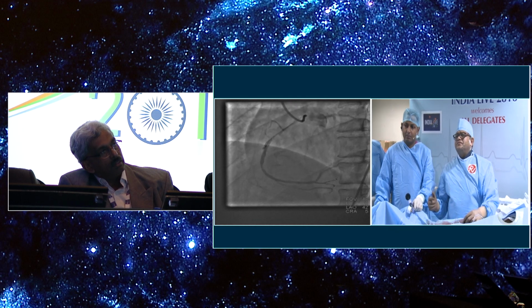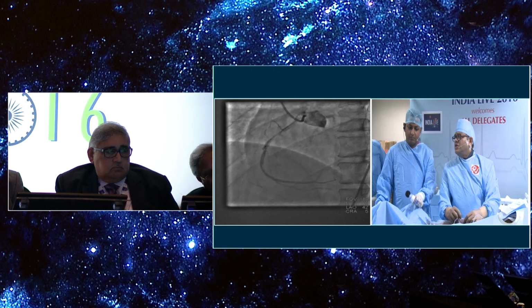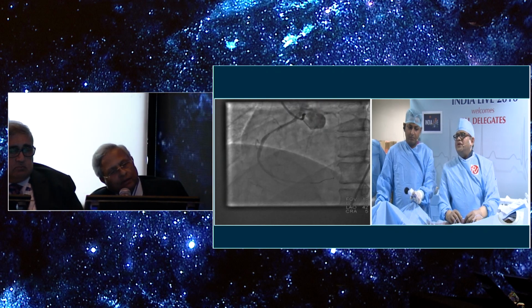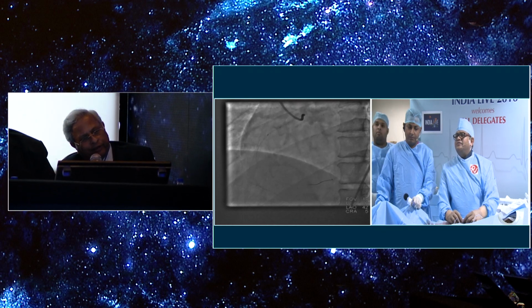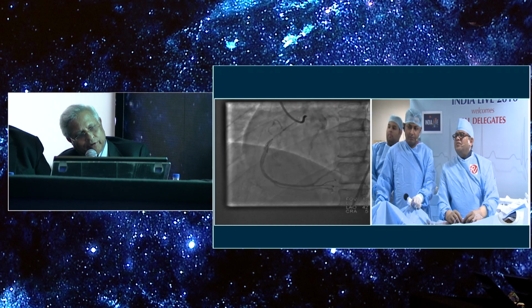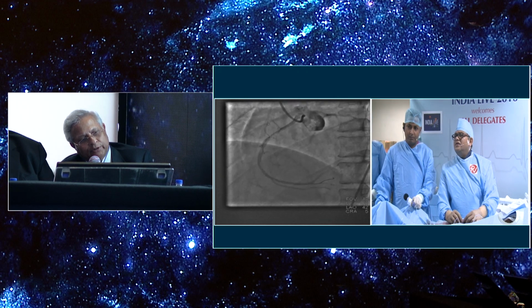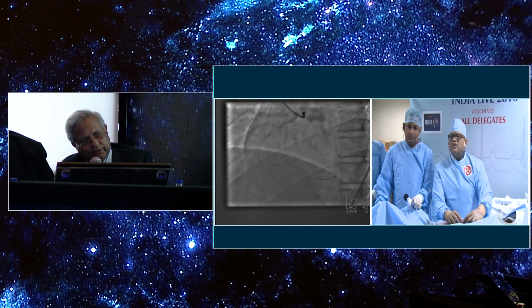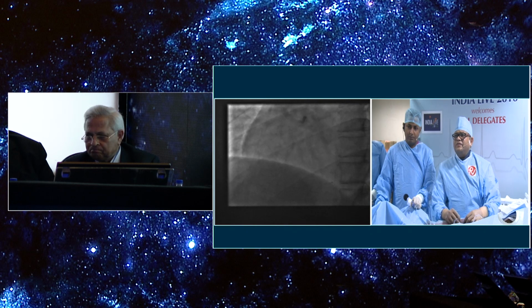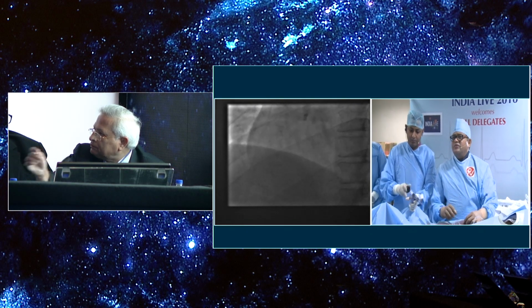Rajesh, this is Dr. Vijay Bang. Can you hear me? Yes, I can hear you. What I suggest is, if you rotate anti-clockwise or clockwise, you will be able to engage the guiding selectively into the ostium of the right coronary. The same guiding, I'm talking about the AL1 that you use. Okay, let me try it. Let me try it. Inflate the balloon, please.